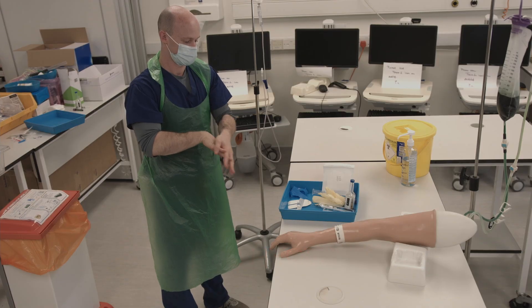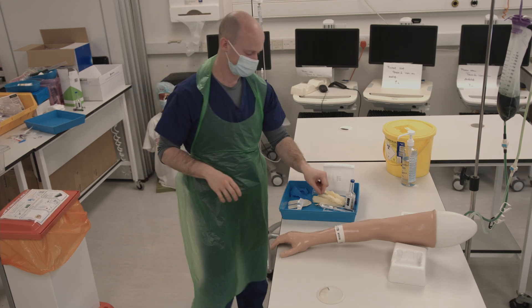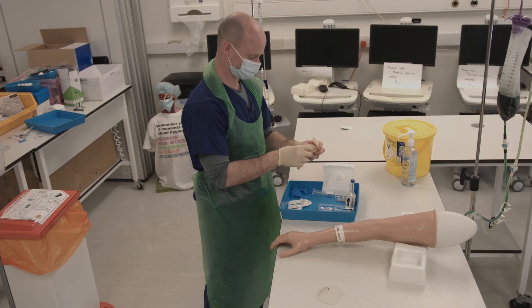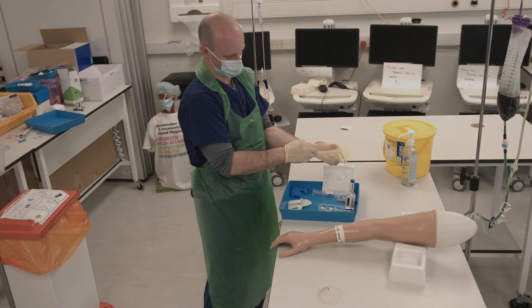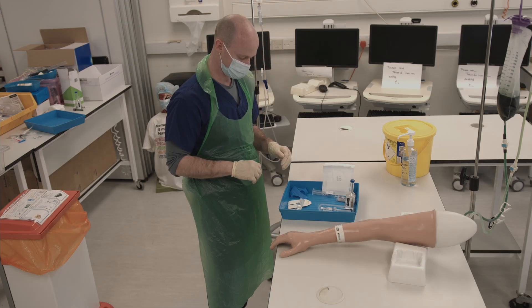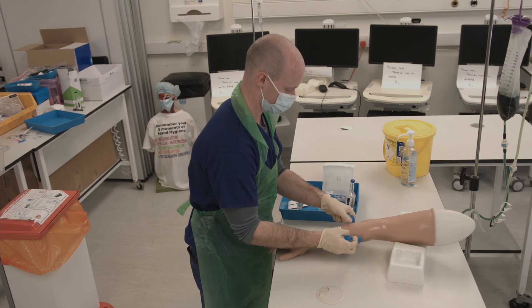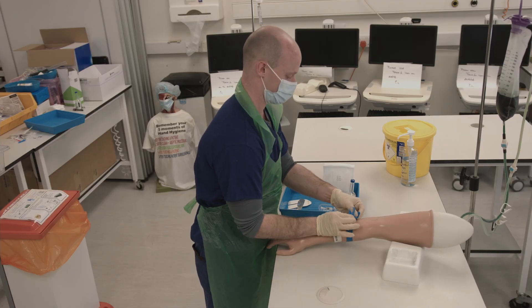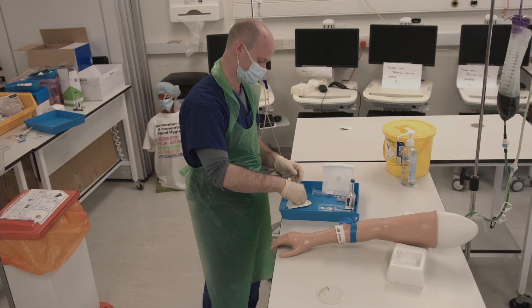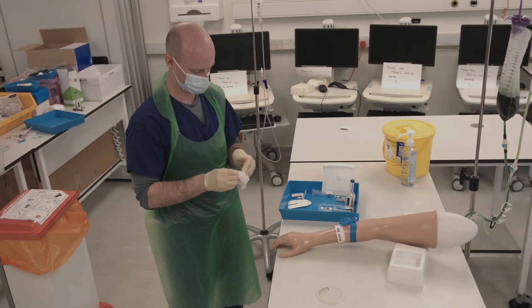At the patient bedside, clean your hands thoroughly as before and put on your non-sterile gloves. Identify the patient by their wristband and place the tourniquet. Palpate for a vein and open a chlorhexidine wipe into a parachute. Then clean the area thoroughly in a grid pattern.